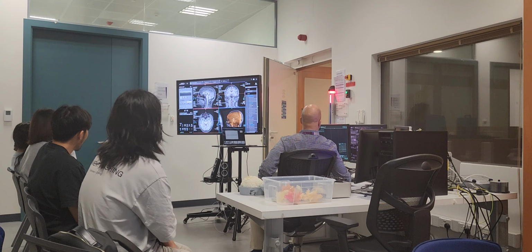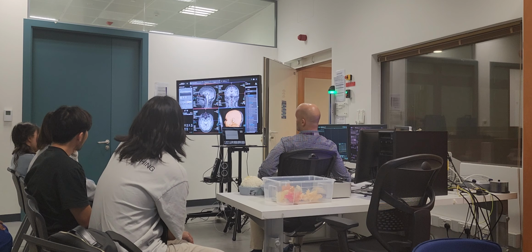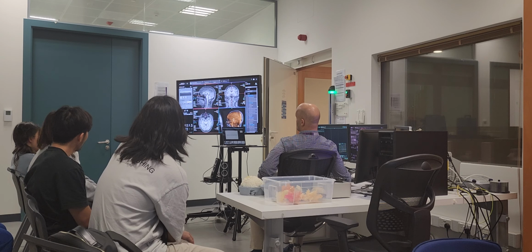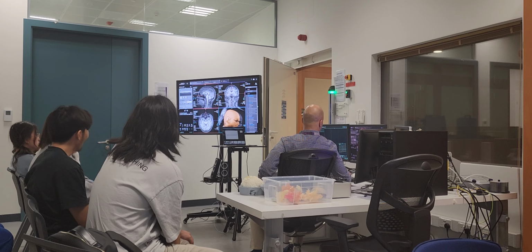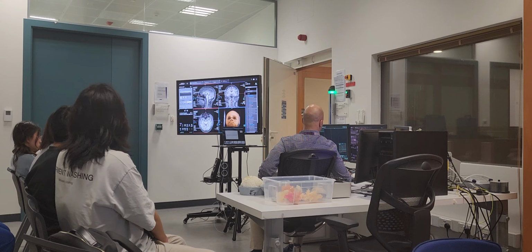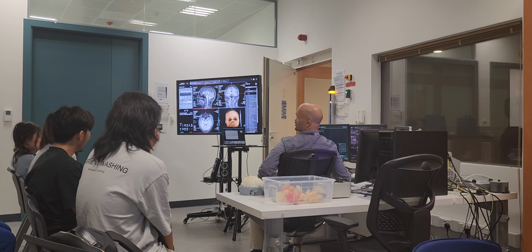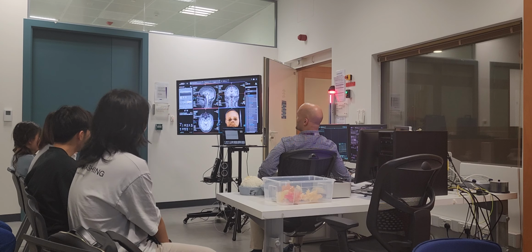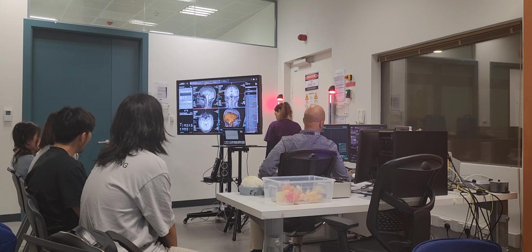So yeah, it's acquiring. You see, any tissue that has hydrogen shows. Okay? Because different tissues have different T1s and T2s. Okay? And you can actually put it in your slides, like when you put it in your profile at NYU. This is how. Okay, but here's the brain.